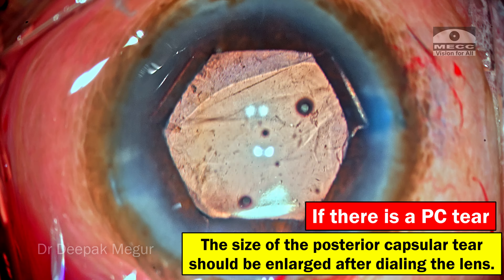My diagnosis of localized zonular dehiscence seems to be holding true. The next strategy is introducing the CTR to support that area. Inflating the bag with a cohesive OVD is much better and safer so the CTR has enough space to be manipulated without causing stress on the capsular bag. I'm introducing the CTR so that the area of the zonular dehiscence is supported as the CTR is threaded in. Note that my second hand has the Sinskey hook anchoring the CTR as it is introduced into the bag — this helps prevent stress on the capsulorhexis margin as well as the zonules.